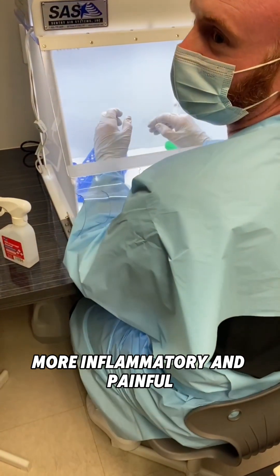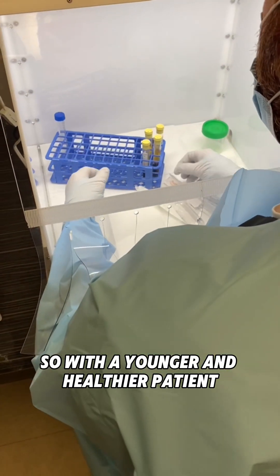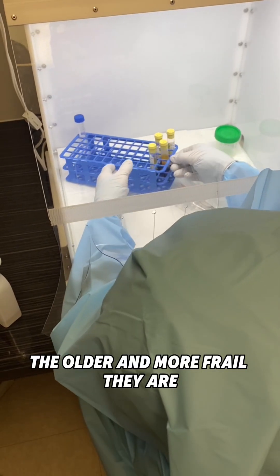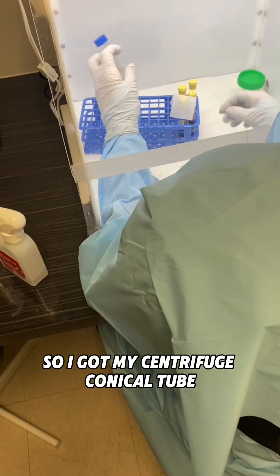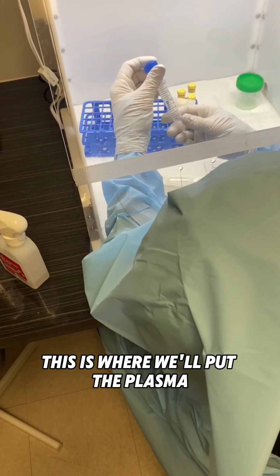The red blood cells make the injection more inflammatory and painful. The younger and healthier the patient, they can tolerate that a little bit. The older and more frail they are, the more important it is to avoid them. So I've got my centrifuge conical tube — this is where we'll put the plasma.